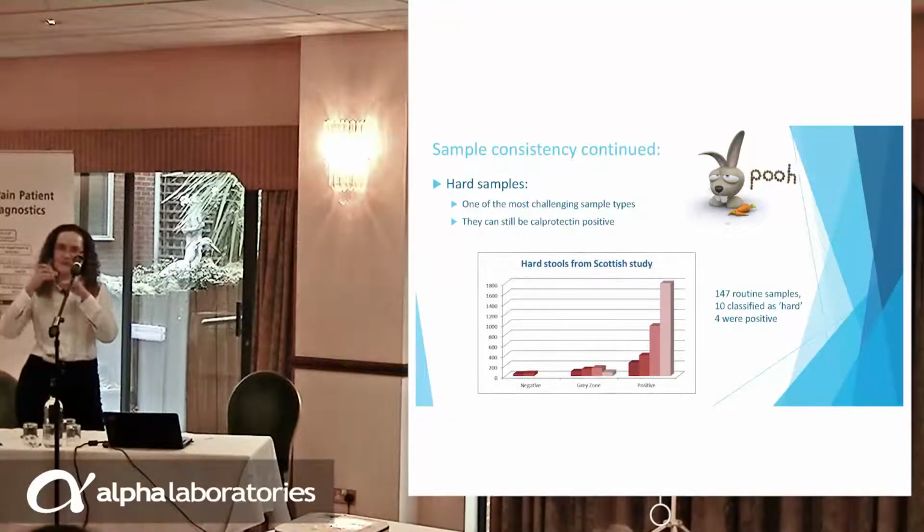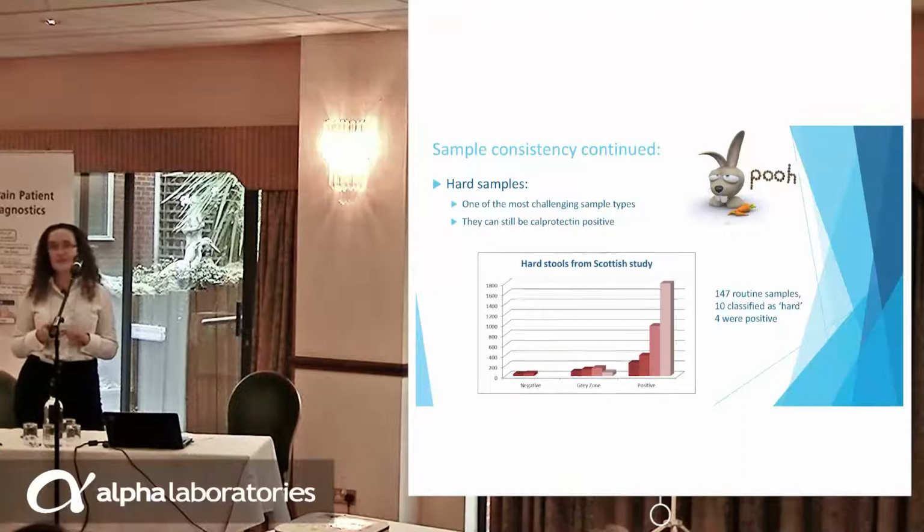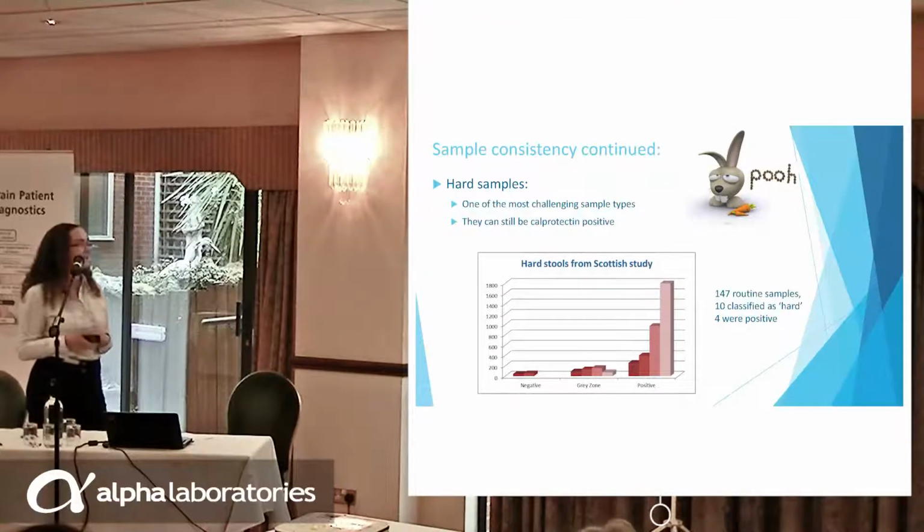You've got to try and squish them, split the samples in half and try and get the exact amount you need into the weighing thing. Or if you're using the extraction device, stabbing them once is challenging enough. Stabbing them 3 to 5 times is particularly difficult.